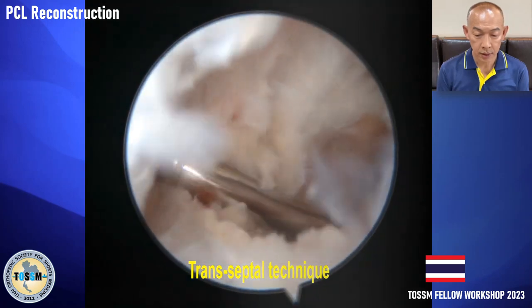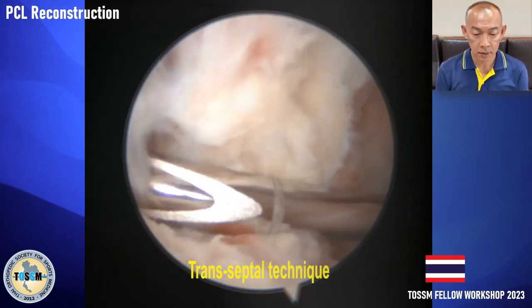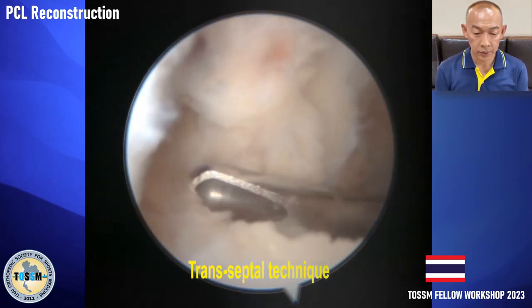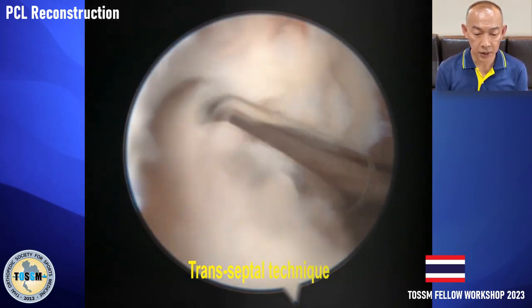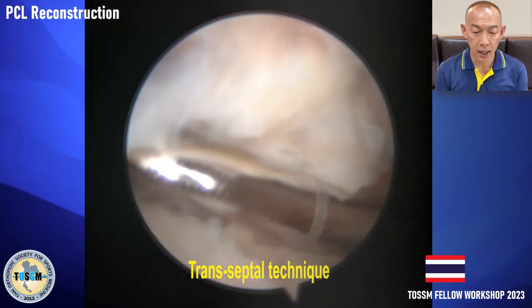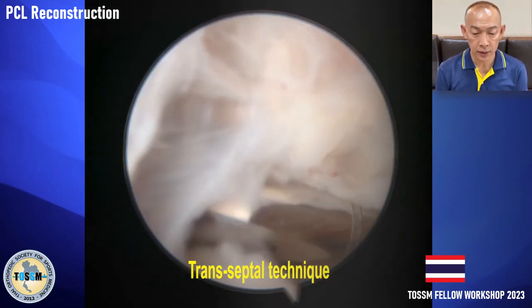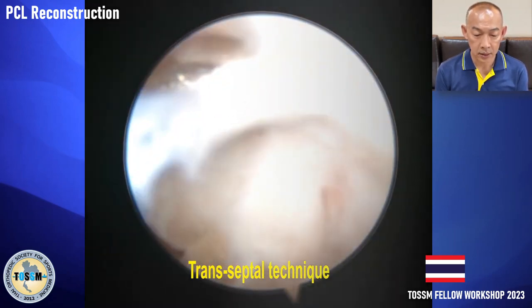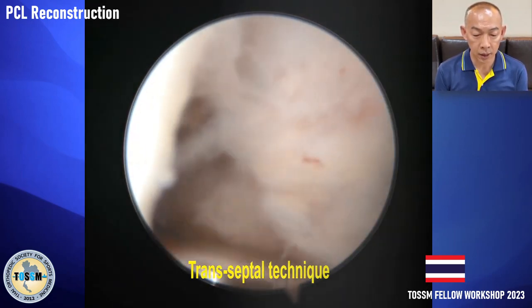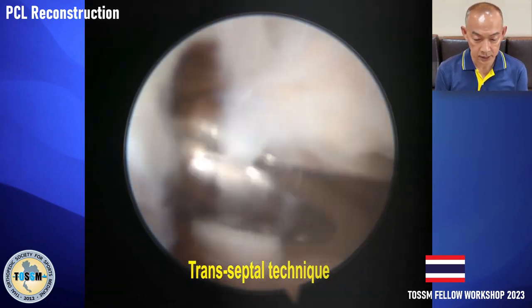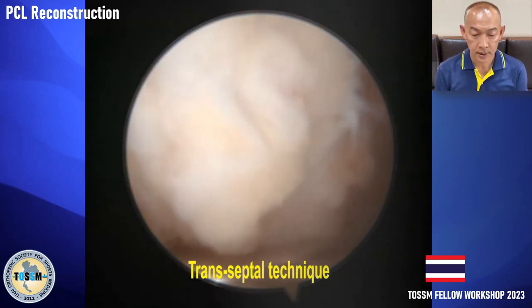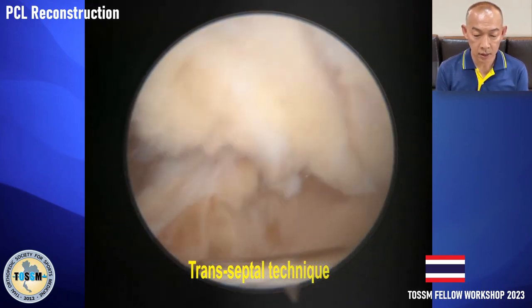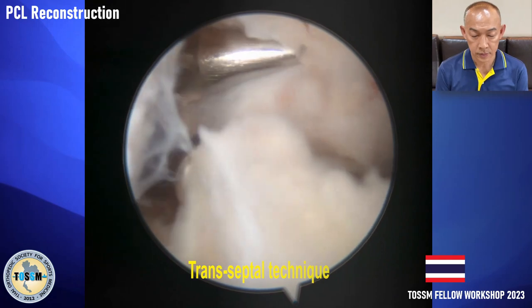The shaver dissects the posterior cruciate ligament from the posterior capsule down to the tibial footprint of the PCL. During this step, you should avoid injury to the neurovascular structures that lie within the posterior capsule and behind the posterior horn of the lateral meniscus. You should keep the shaver turned toward you at all times.